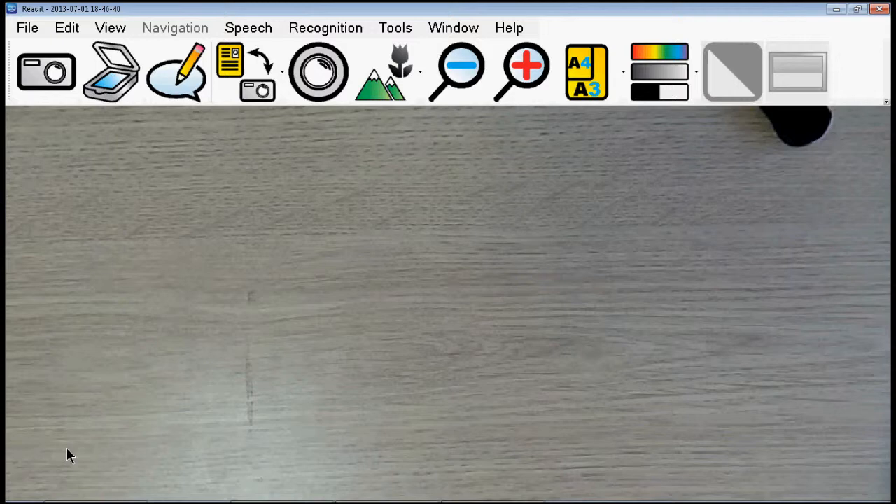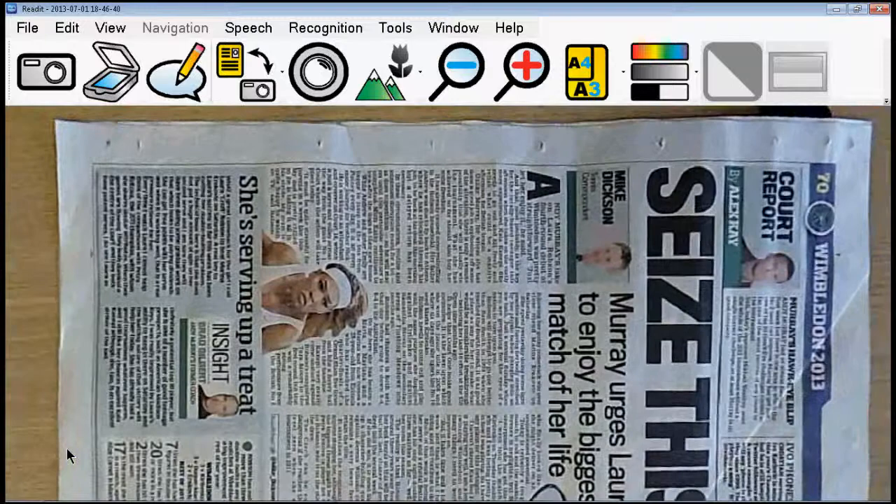Hello, this is Ellis from VisionAid International, and I'm just going to give you a very quick run through on the alpha version of the latest READ-IT software running with the Scholar camera — the new Scholar HD camera, which as the name suggests is now full HD live image quality at 60 frames per second. I'm going to start with the READ-IT software running here with the camera pointing down at the desk.